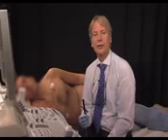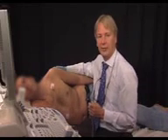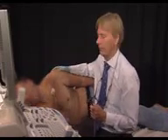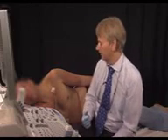To quantify aortic stenosis from a right parasternal approach, we also need the pencil probe. It is also important to position the patient in a position where he's turned as far as possible towards the right. And then we have to remember what the anatomy of the heart is and where we can actually expect the jet to be or to go.